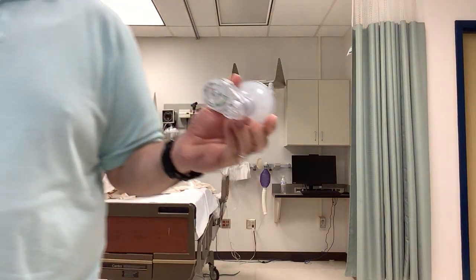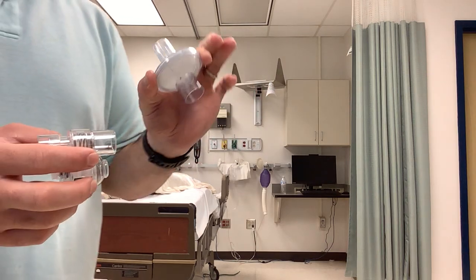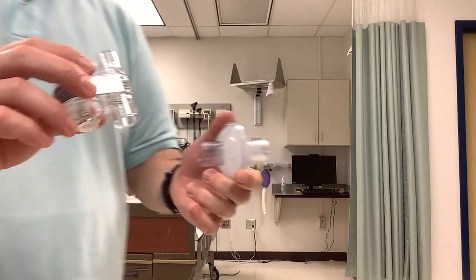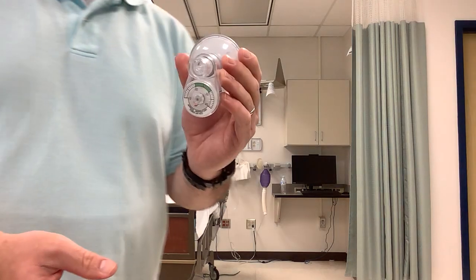Here is a disposable NIF-meter. This one is configured so that it can be utilized with an endotracheal tube — you just put that down over the hub of the endotracheal tube. However, I'm going to rig it up so that we can utilize it with our mouthpieces.